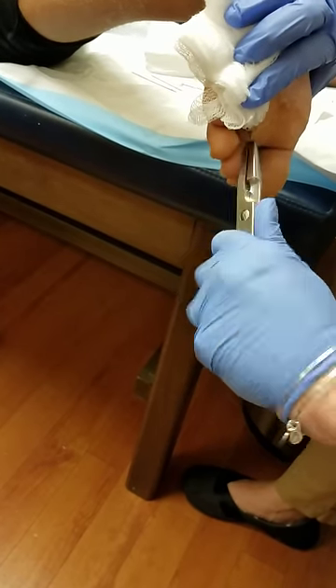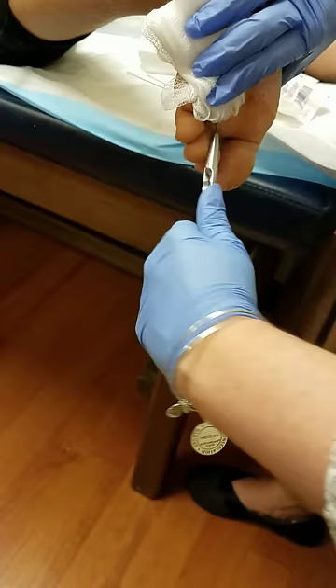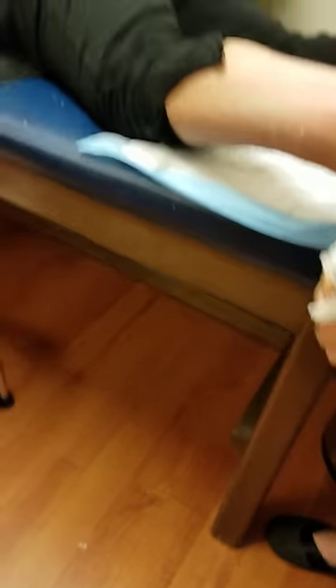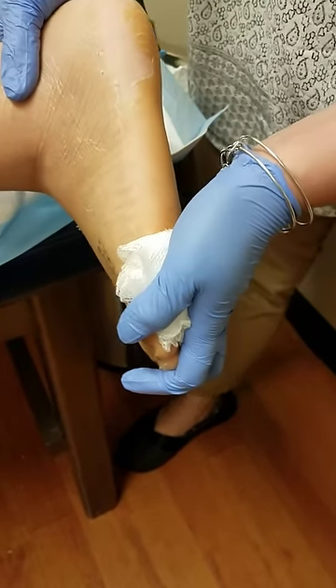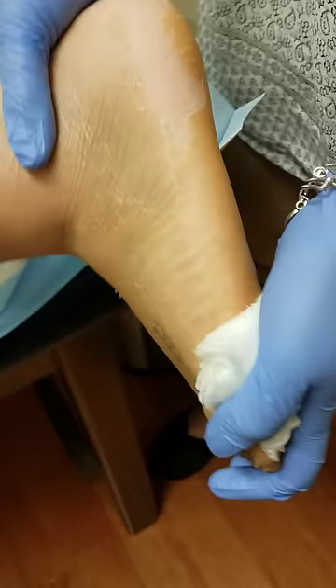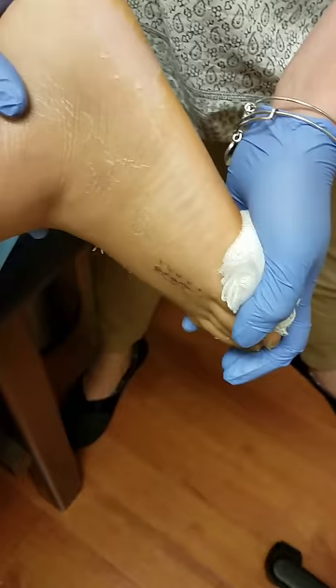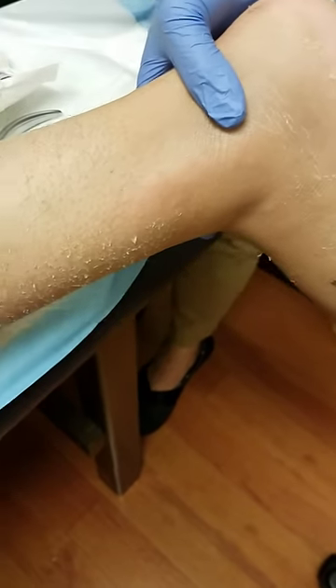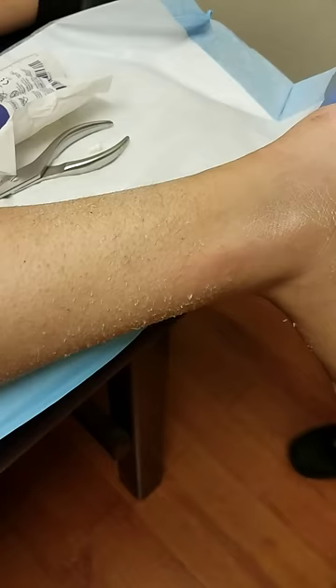It's almost done, baby. I'm sorry. I'm almost done. Hang in there. All done. Ain't gonna happen no more. It's over with. You okay? I'm sorry, baby. It's okay, honey. Does it still hurt now? The skin probably hurts a little bit where it comes out. It'll be sore. She's just holding it because it's going to have pressure. It's done now. You're done. It's gonna be sore, like a sand spur.